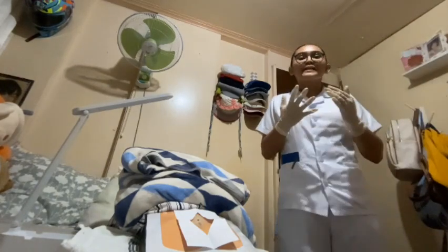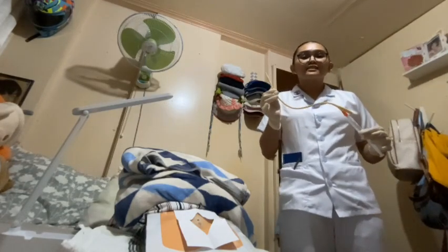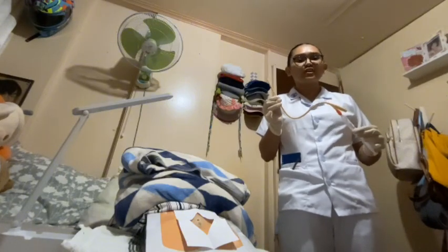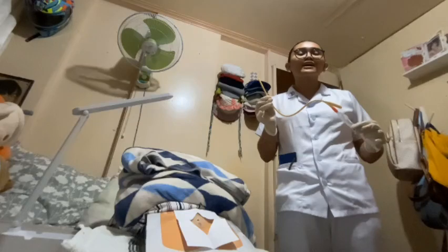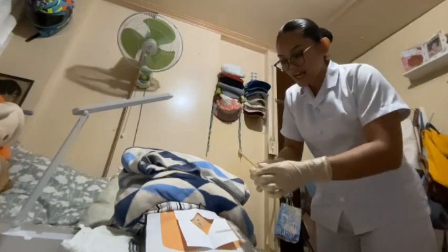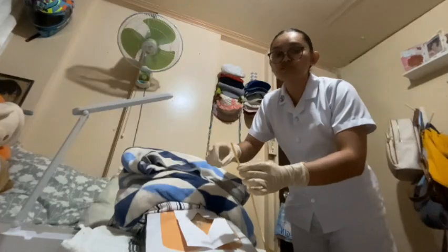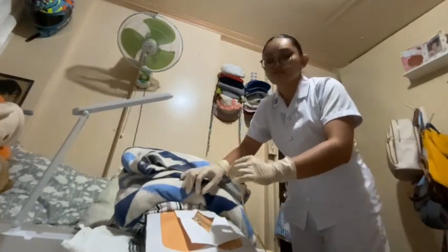Now I will pick up the catheter 3 inches from the tip and place the thumb and one finger of the left or right hand between the labia minora and separate and pull up gently so the meatus is clearly exposed and the sterile catheter tip remains uncontaminated. Then I'm going to insert the catheter within 2 to 3 inches or until urine flows, because the return of urine confirms correct placement in the bladder.